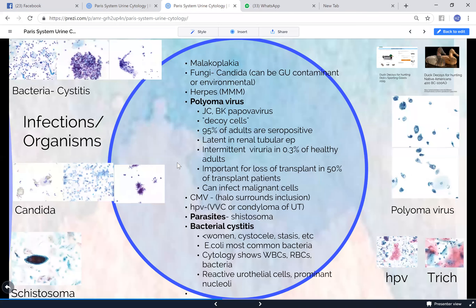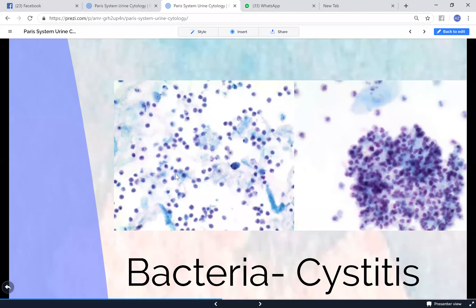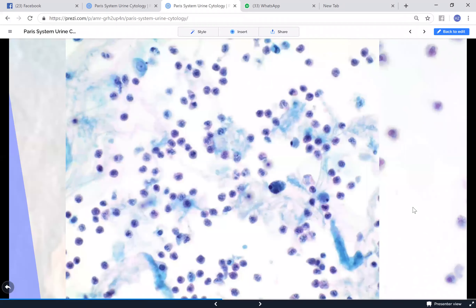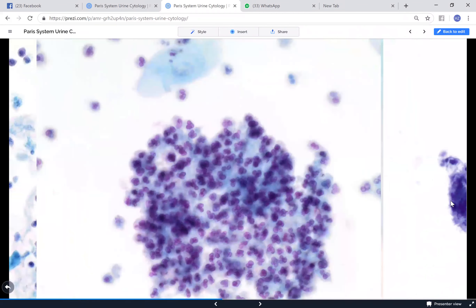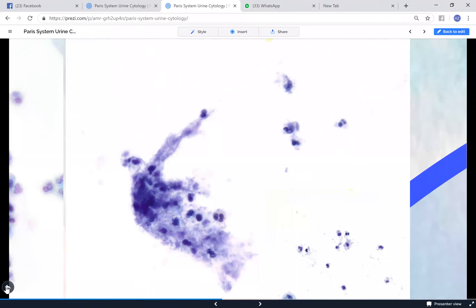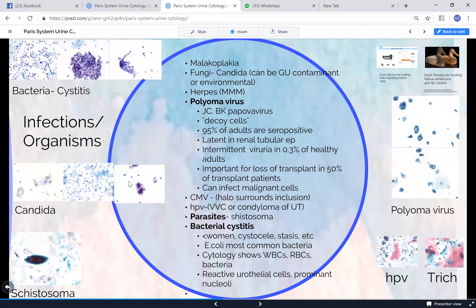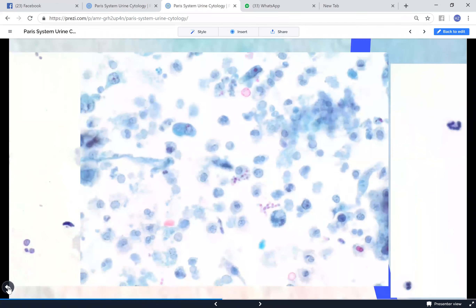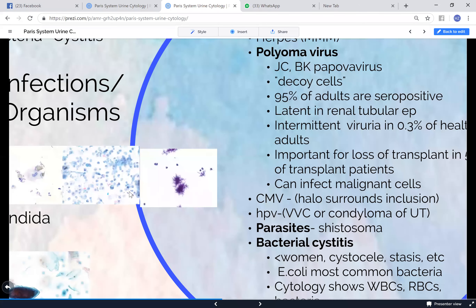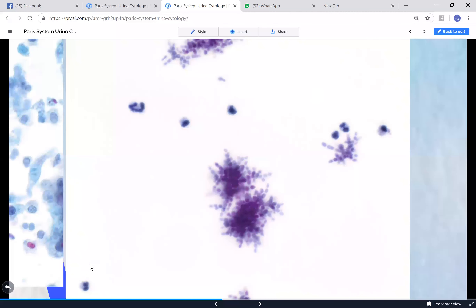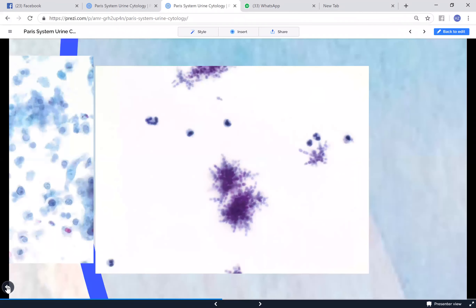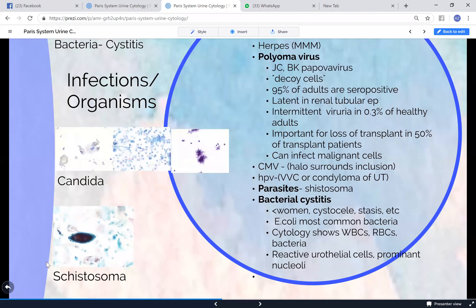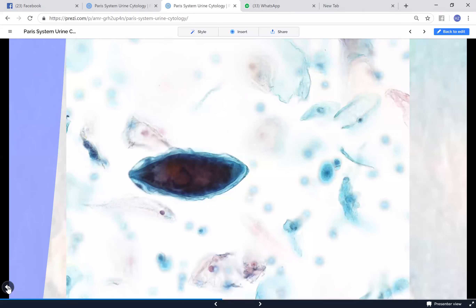Organisms are common findings. With bacterial cystitis you will see a large neutrophil reaction; if bacteria are just contaminants you won't see the body reaction. Candida is also very common, usually from the genital tract, and may be contaminant. Schistosoma is another important finding - those present in certain regions see this more frequently than others.